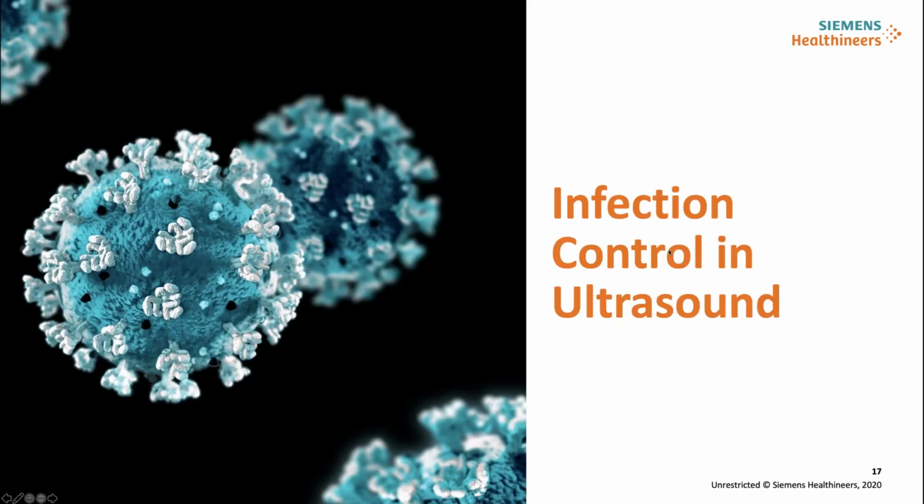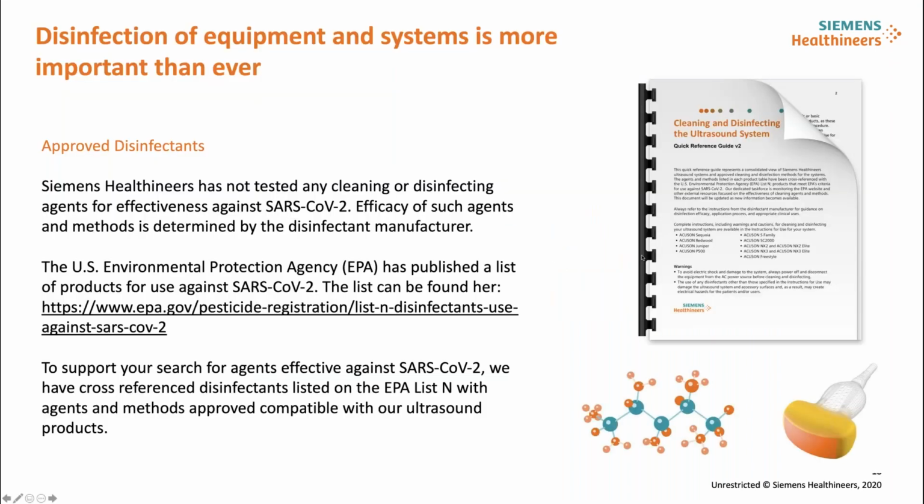It's the part where I'm going to talk about cleaning, disinfection, and how to make sure there's no contamination. Because believe it or not, the biggest question now asked in the world about ultrasound is not how to detect the disease or how to scan, it's how to clean the system. This is the most important topic in everybody's mind, because ultrasound is used so much. How am I going to clean the transducer, how am I going to clean the machine itself? Because maybe you're going to scan 10 patients per hour. So if you don't clean it properly, you're going to maybe spread more, so you have to avoid this at all costs.